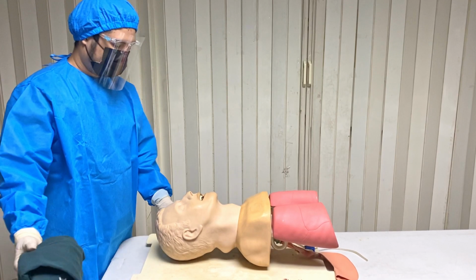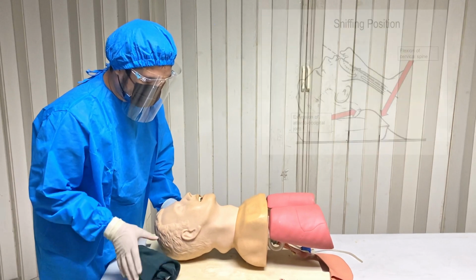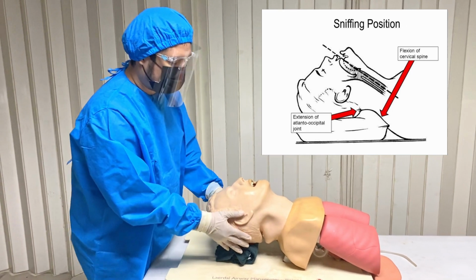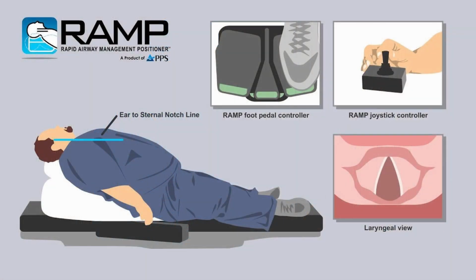You place the patient in a sniffing position for optimal air passage. Folded towels or other materials may need to be placed under the head, neck, or shoulders so that the neck is flexed on the body and the head is extended on the neck.